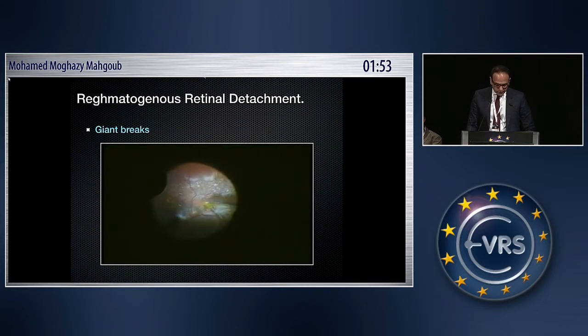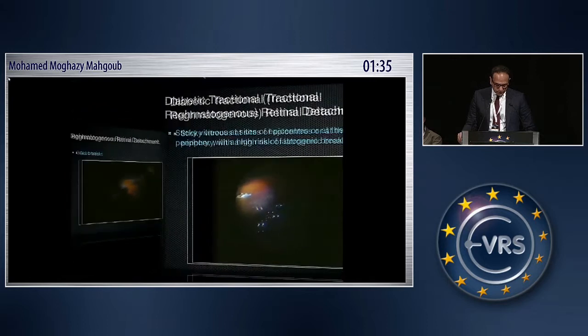Another case of a giant retinal break — again, you don't need to use PFCL. You just use air, which provides a continuous flow. Unlike PFCL, which requires adding more incrementally, air also avoids the potential complications associated with PFCL use.